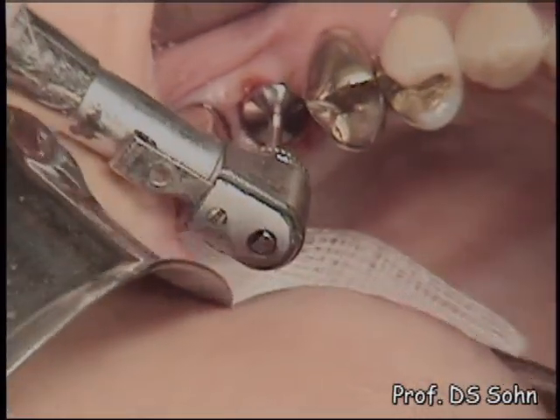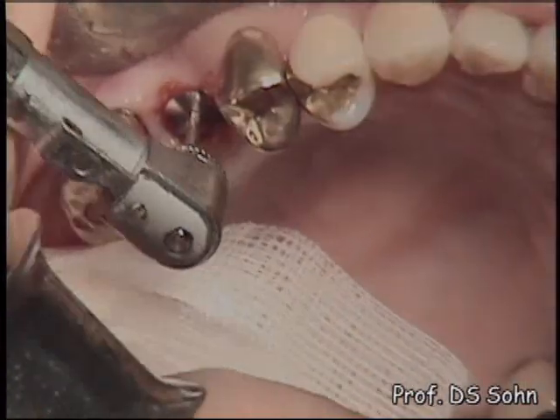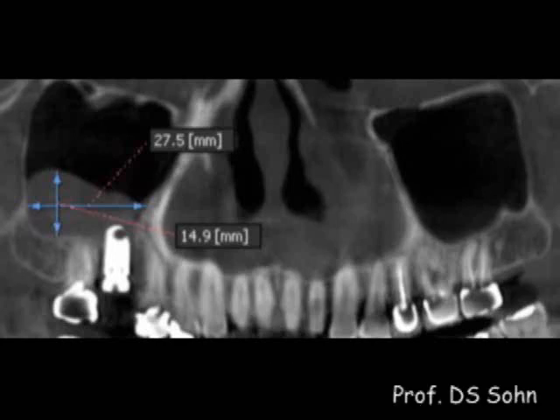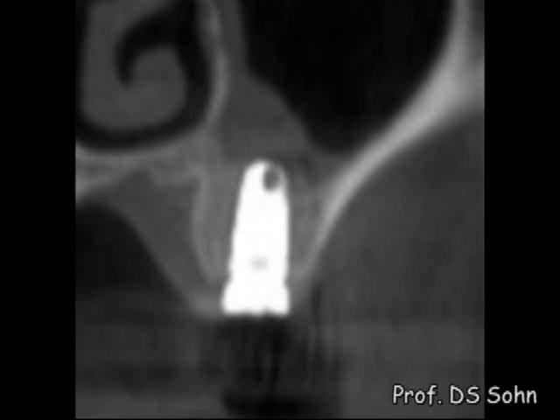A healing abutment was positioned on the implant platform as a one-stage procedure. The panoramic view of cone-beam CT shows approximately 15mm high membrane elevation. Unlike conventional osteotomy techniques showing localized dome-shaped sinus elevation, the HPS technique induces broad and gentle elevation of the sinus membrane, similar to the lateral window technique. The cross-sectional view of cone-beam CT shows broad elevation of the sinus mucosa buccopalatally.